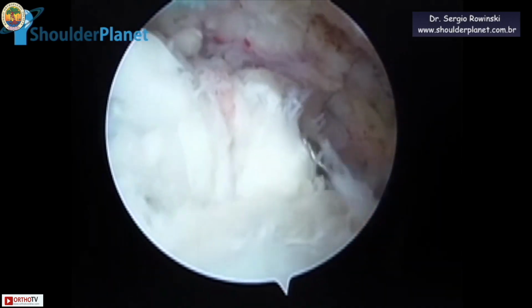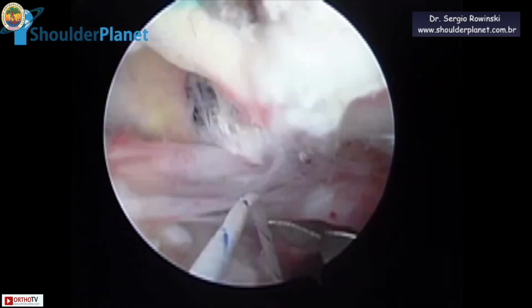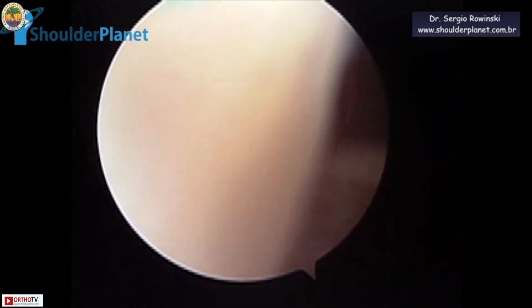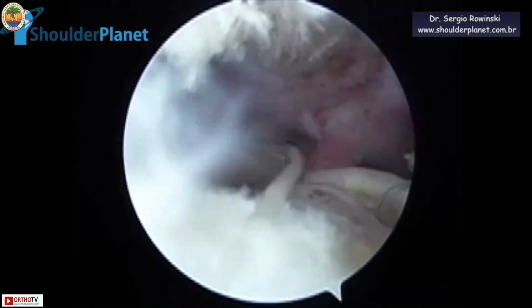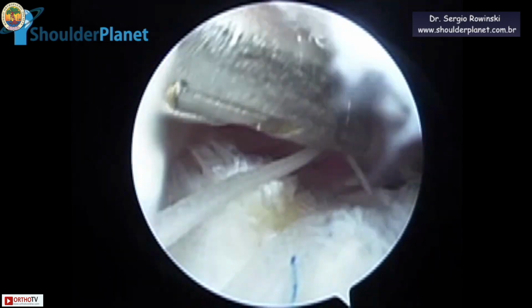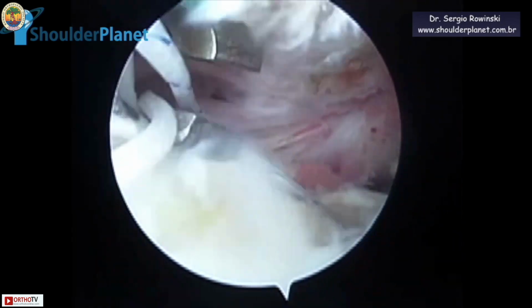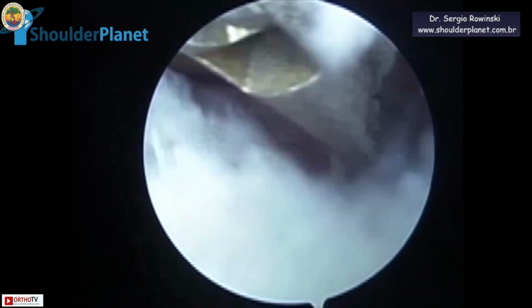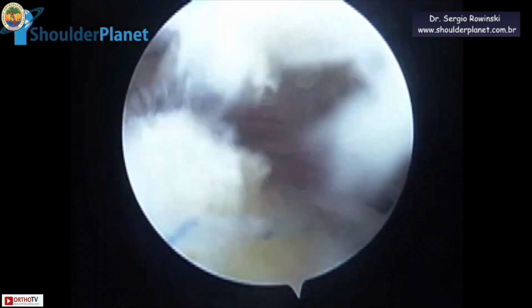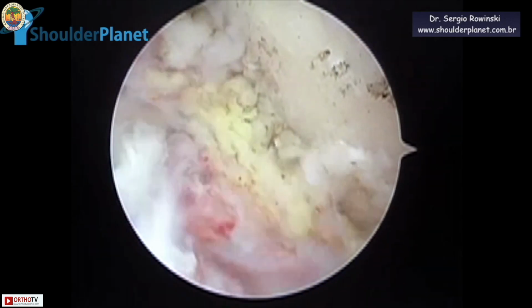So entering through the posterior portal with a bird beak, we passed the sutures, the first one in a retrograde fashion, out of the posterior portal. This is what we are doing now. And at that moment, we decided to tie that knot, so we would have to isolate very carefully the white suture, because we don't want to make a mess with the suture at that moment of the surgery. So we put the blue one out of the anterosuperolateral portal, and this is what we are doing now.